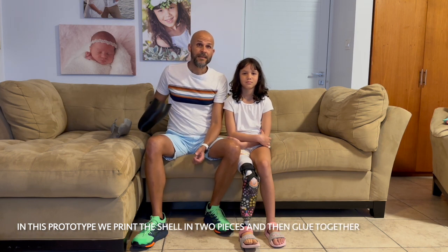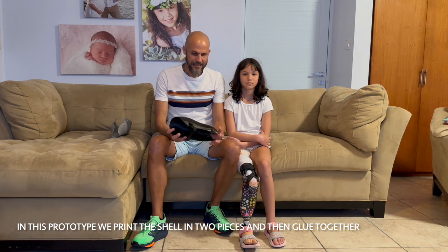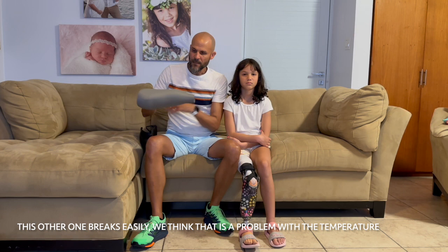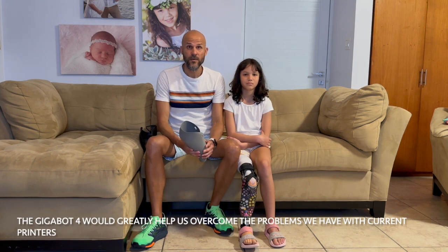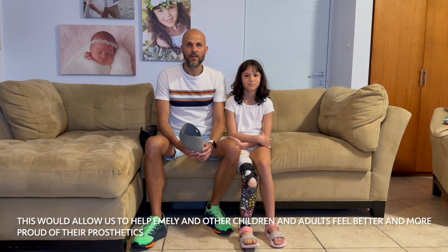In this prototype we print the shell in two pieces and then glue it together, and this one breaks really easily. We think that is a problem with the temperature. The Gigabot 4 will greatly help us overcome the problems we have with the current printers. This will allow us to help Emily and other children and adults feel better and more proud of the prosthetic.